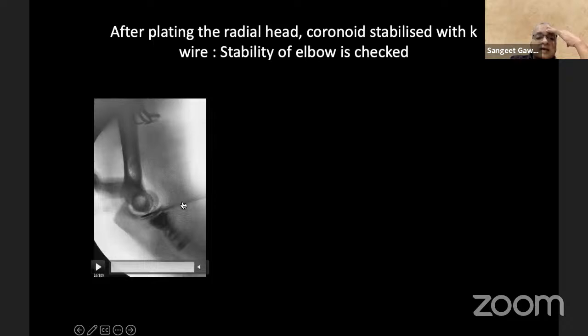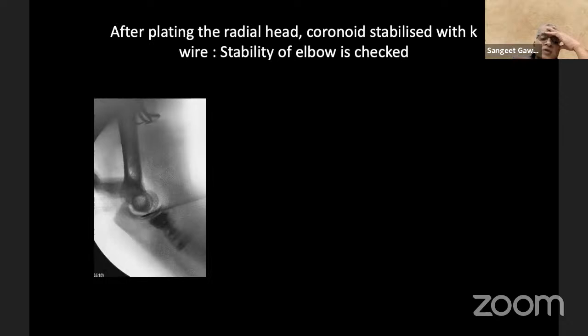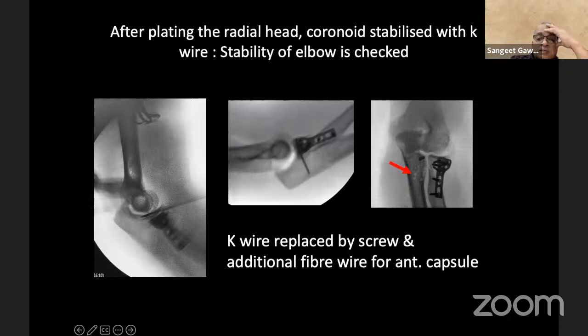So can you see that? The coronoid is fixed with a K-wire. And we are doing his complete extension. The elbow is stable. So that means that fragment is important as far as the stability of the elbow is concerned. So that fragment was replaced. The K-wire was replaced with a long screw. Okay. And you can see these multiple drill holes here. So these are for the repair of the anterior capsule. So the K-wire was replaced by the screw and additional fiber wire were used for suturing the anterior capsule.